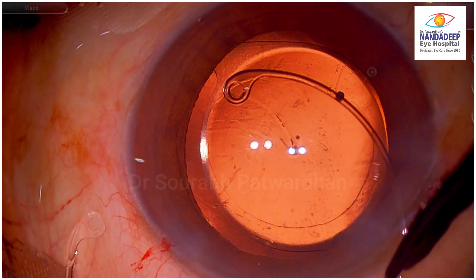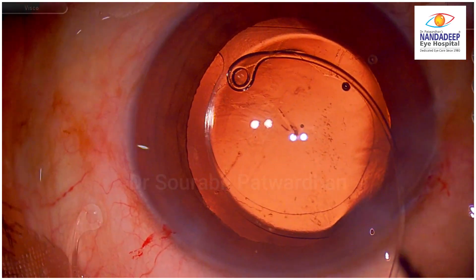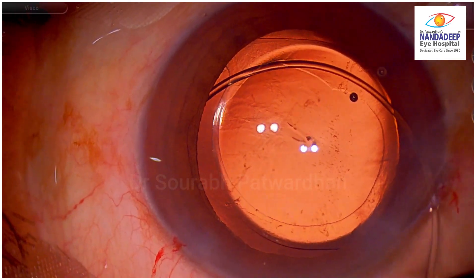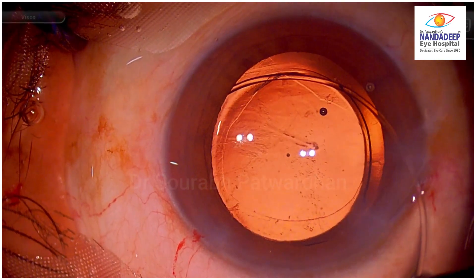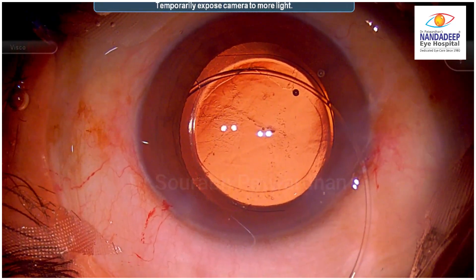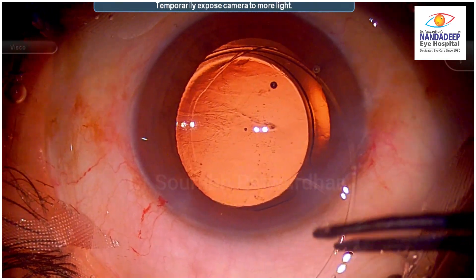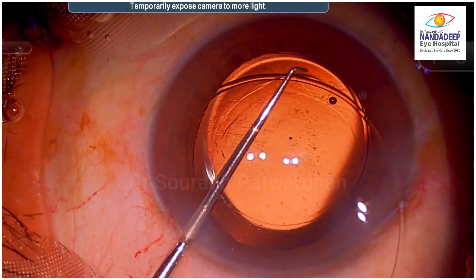The first thing the surgeon has to watch out for is that the first eyelet should go into the bag — we have to lift the CTR just a little bit so it goes underneath the capsule, which has been done properly. Now as the surgeon tries to push in the CTR, you can see that the CTR is trying to get out of the bag, which is very natural. These CTRs are very springy and you have to push them down into the bag and guide them in.